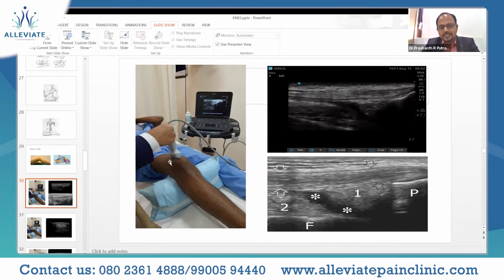Okay, so this is a sagittal scan of the suprapatellar area, where you can see the different structures. The different appearances of the different structures under the ultrasound are also very important. So ultrasound is just a universe of black, white and gray. All right, so within that, this is the quadriceps tendon, a thick quadriceps tendon which appears multi-layered, with hypoechoic shadows and linear hyperechoic bands within it. So this is the appearance of a normal tendon.